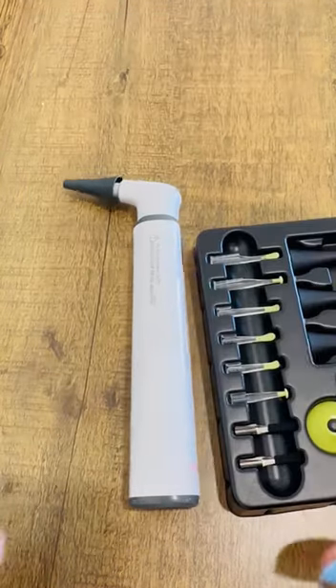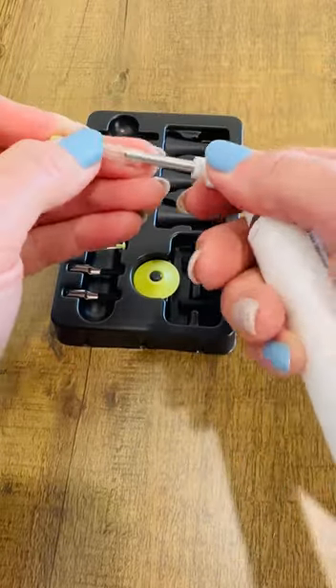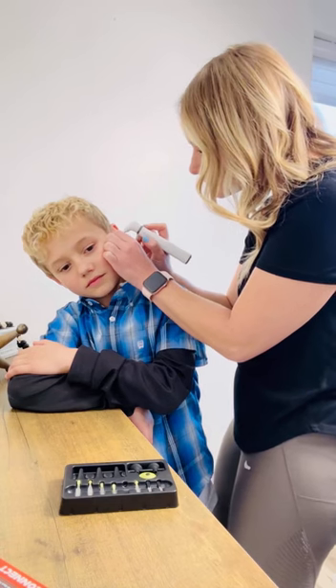This Mobi Ear Cleaning Accessory Kit has been a game changer for my family. It pairs perfectly with the Mobi Technology Smart Wireless Wi-Fi Autoscope. This Ear Cleaning Kit is perfect for the whole family.